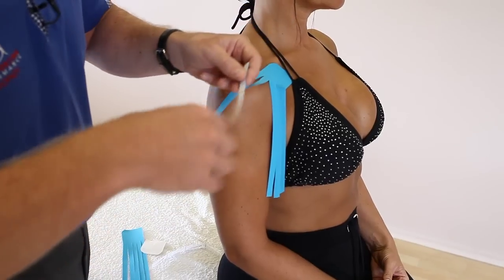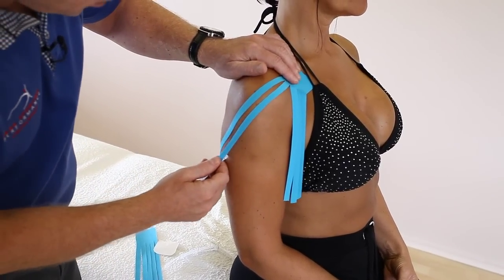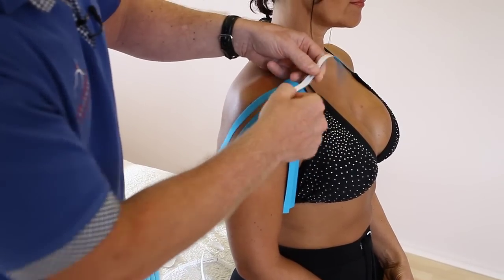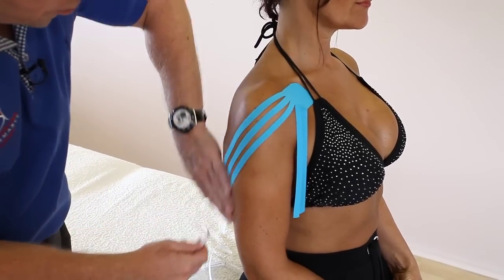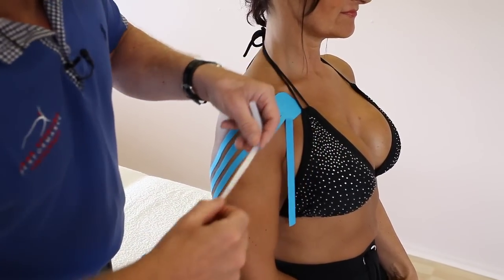And again the second finger. It's very tempting to stretch the tape, but if you can just have a gap between each one and just lay those fingers down. And the same again, so this will be the third one. Imagine you have bruising and swelling in this sort of area — this would be the first application.